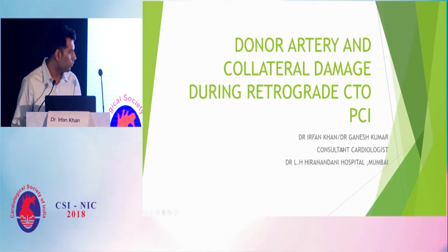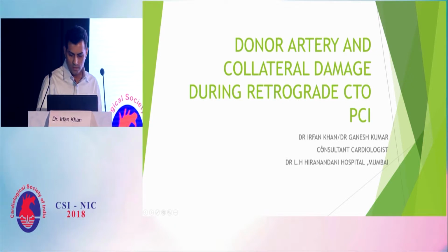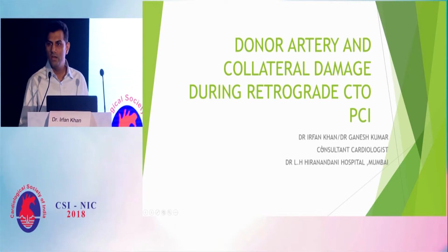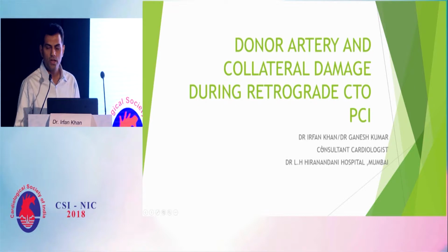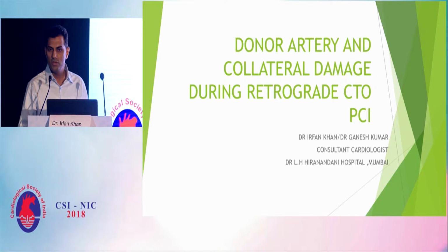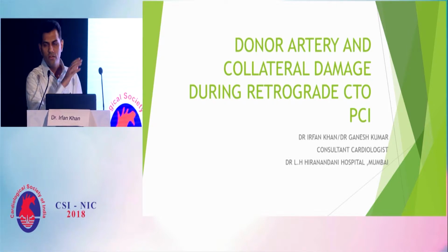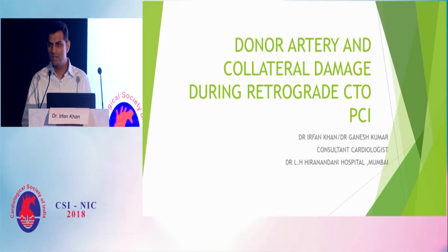Good afternoon. Thank you, moderators. Thank you, chairperson. The basic difference, I think, between an antegrade and a retrograde PCI is that when you navigate an antegrade PCI, you are dealing with an artery which supplies no area of myocardium or minimal, 5 to 10%, of the myocardium. While when you are doing a retrograde case, you are dealing with the whole supply of the myocardium. So if you have any kind of complication, you are jeopardizing the whole myocardium and increasing the risk of on-table MACE events.